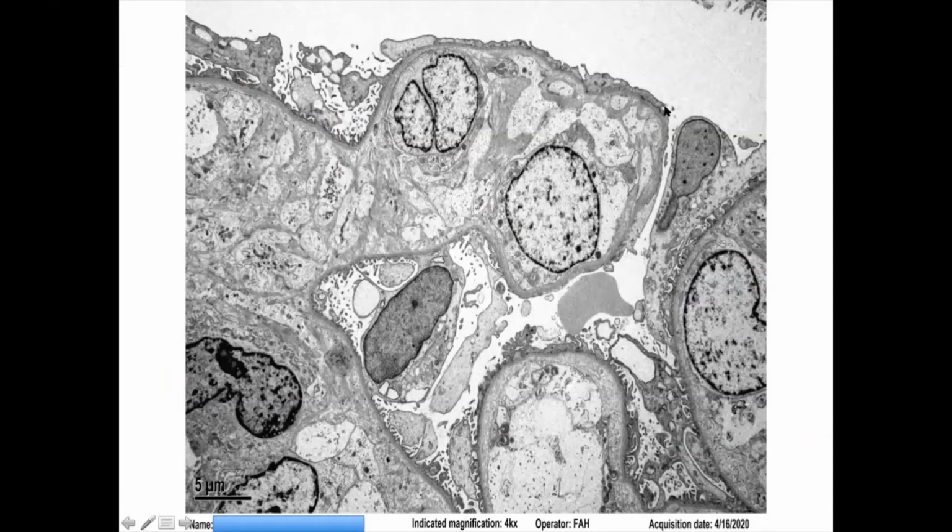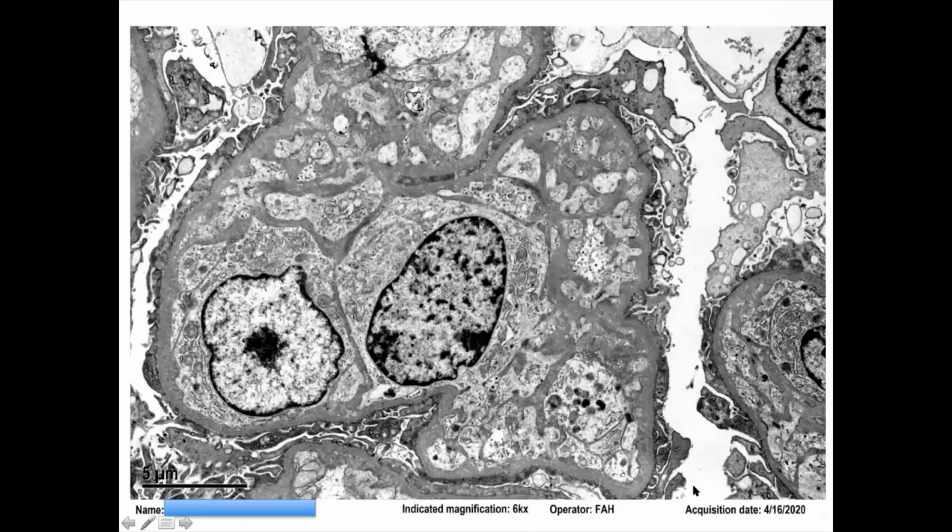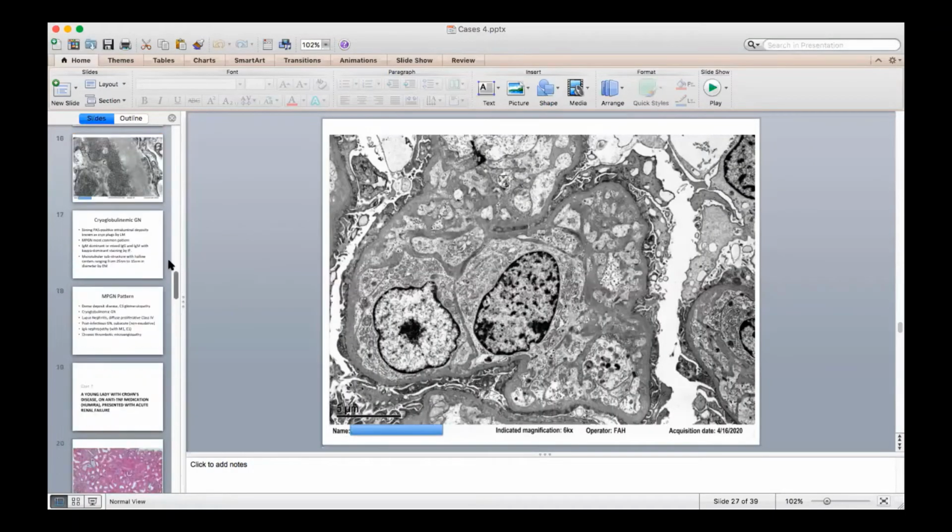We have lots of holes within the glomerular basement membrane, and over here even the mesangium is breaking down, and we have mesangiolysis. The podocytes are flat, they're sitting down. Again, all of these are the endothelial cells. Remember the endothelial cell that we say hello to at the beginning of every session, how flat she is.